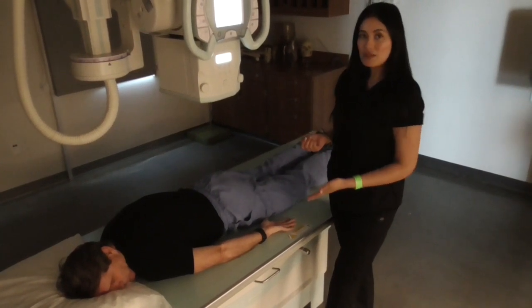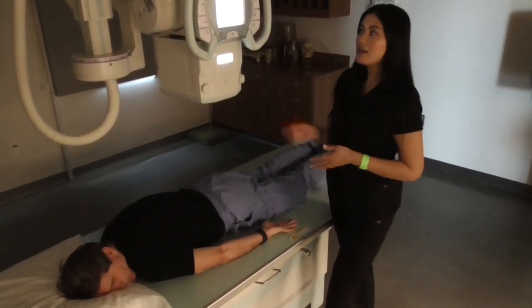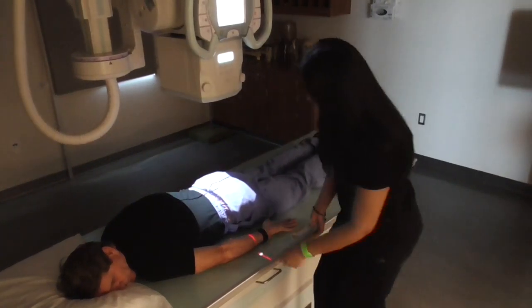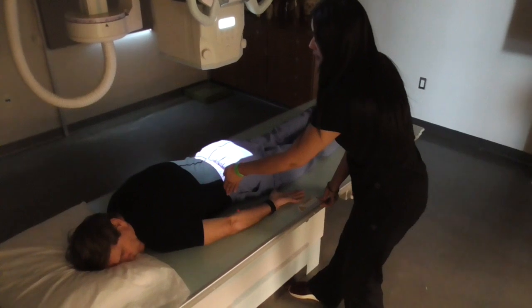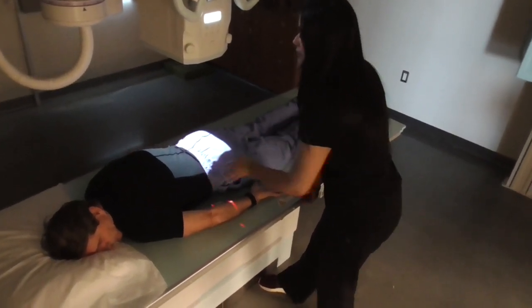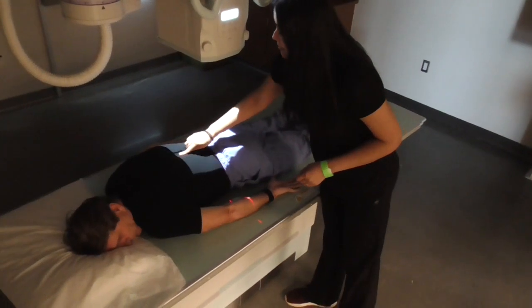We will still be using a 14 by 17 lengthwise with a 40 inch SID. I'm going to palpate and feel for his iliac crest, top of the iliac crest, making sure that I'm going down midline.